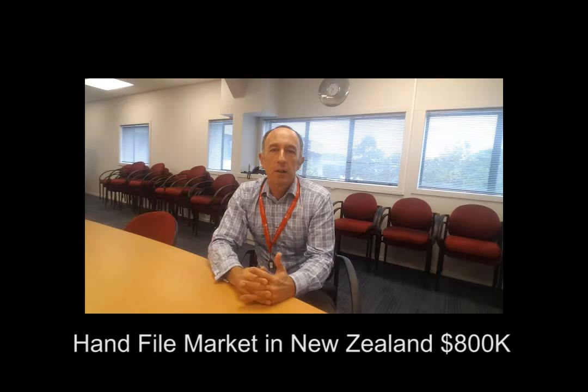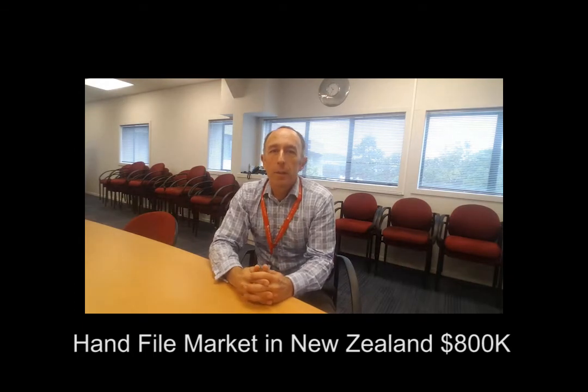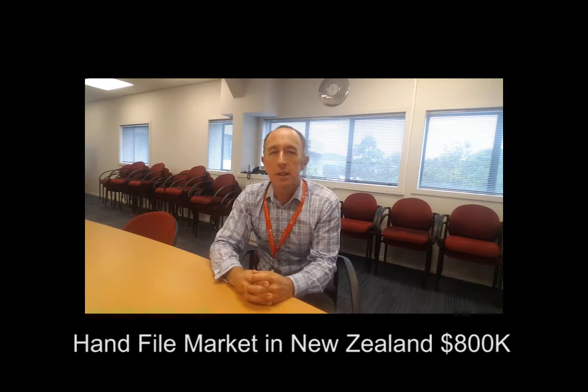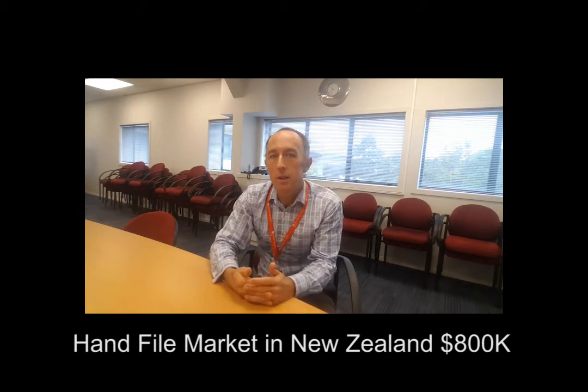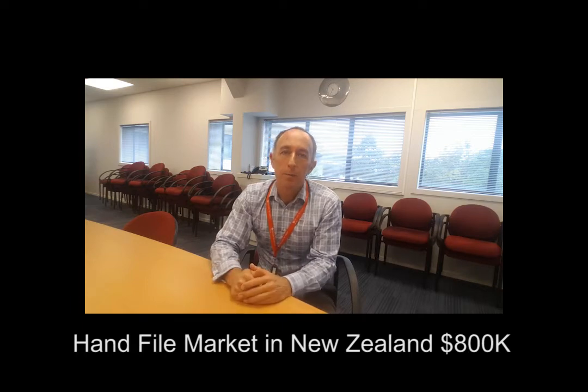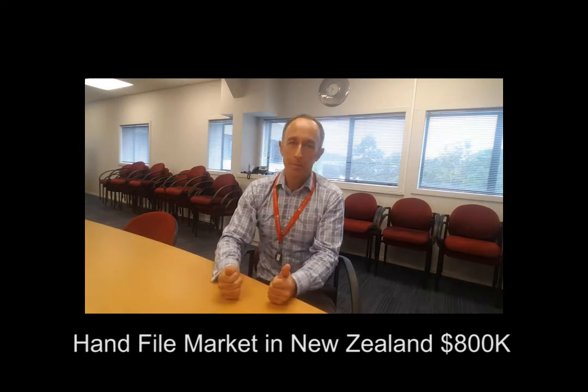Hand files are the second most dollar value piece of equipment that the dentist uses, so it's appropriate that we do a little bit of training on these and understand a little more about how they're used, where they're used, and why they're used. That's what this video is about. So here we go.